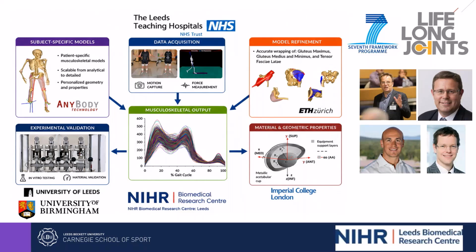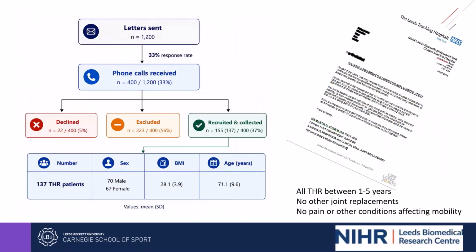But I'm going to go into the data acquisition bit, because this is the data that you'll receive, that has been released as open access through the Nature Scientific Data journal article. I did want to start a little bit with just looking at how we recruit our patients, because I think it's often forgotten in terms of how important it is that we get our patients into the lab and they allow us to use their data.